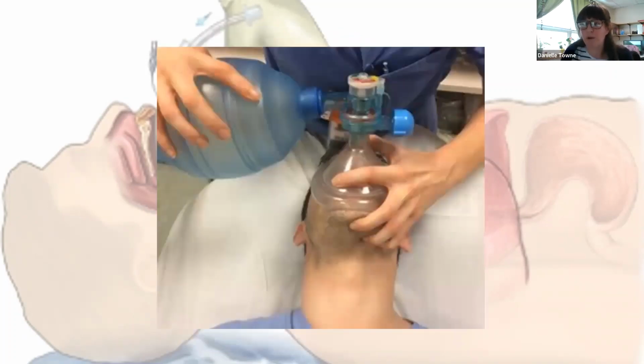When we do that, we want to look at the chest and observe the rising and falling for normal respirations. Listen for air movement. Is the breathing pattern normal? Is the rate normal? Is it too fast or too slow? If the patient's not breathing, or if they're breathing too slowly, then you can consider using a BVM to manually give breaths since they're unable to do it on their own, right?